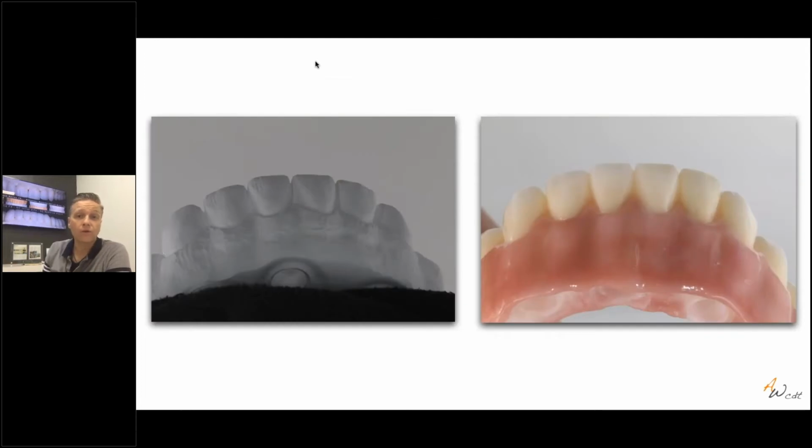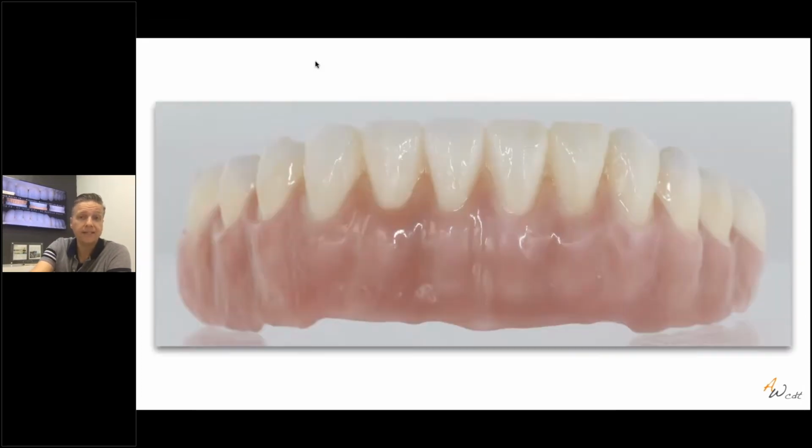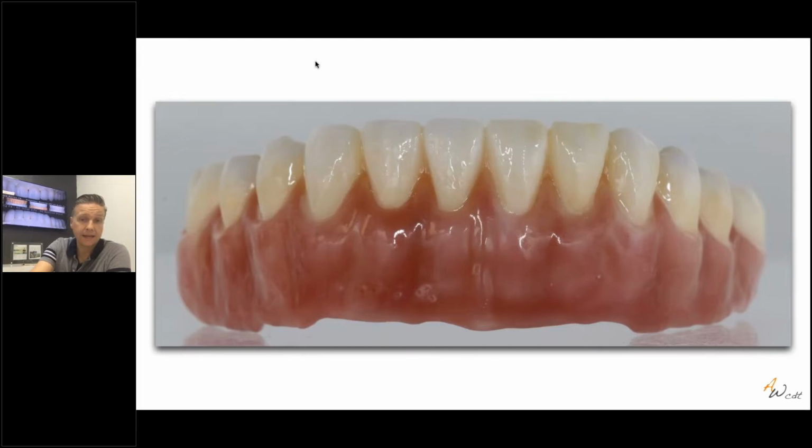Or we're looking at full arch reconstructions. So both restorations are totally different, but they have something in common. They are both full contour, except here I have to admit the pink is layered, but anything else is full contour, full anatomic, designed, milled, stained and glazed, as well on this restoration. So that's what both restorations have in common, even if they're so different.